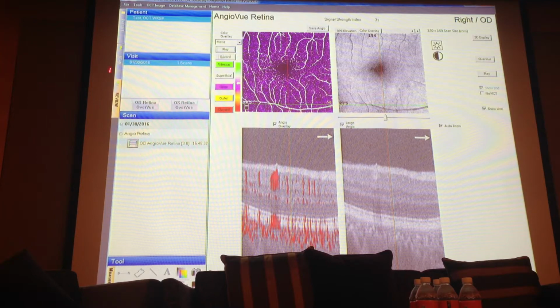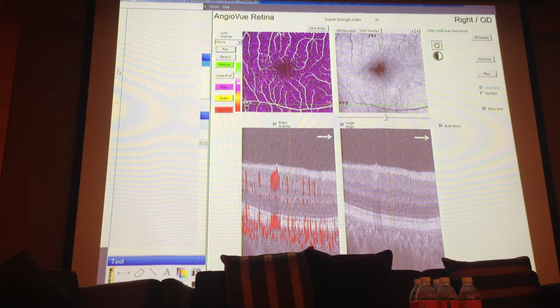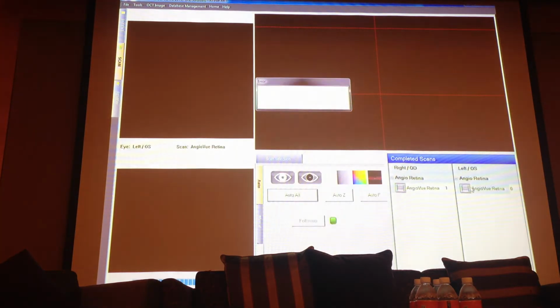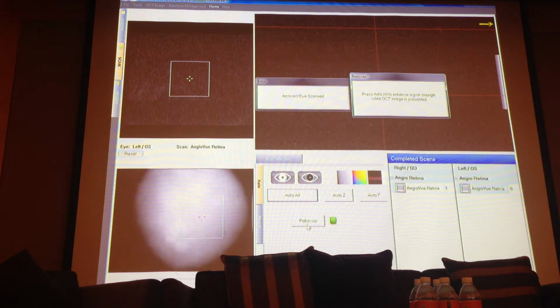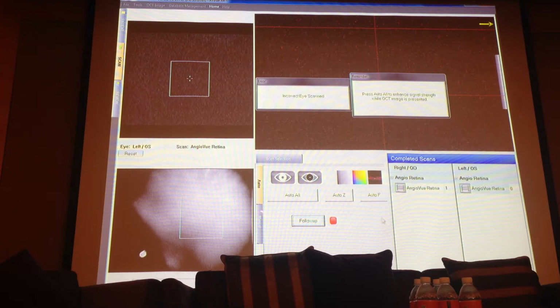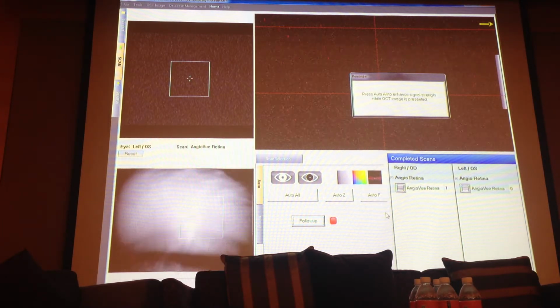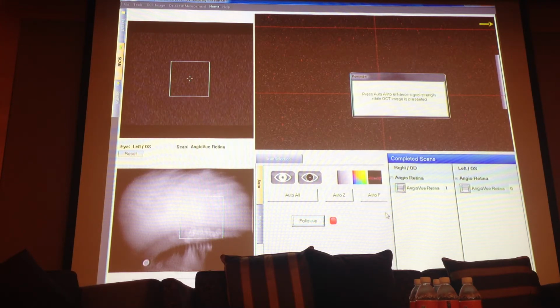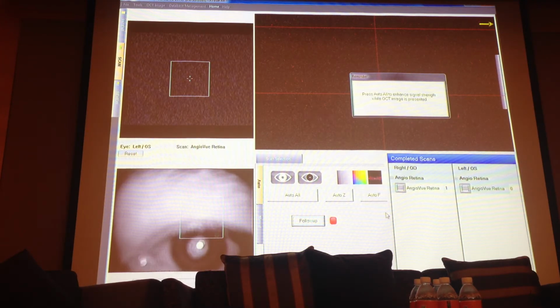Now we get back to the scan. I think we should take a 6 millimeter scan. I can't select 6 mm because of the resolution. What if you unplug the projector? Yeah, it's the resolution. I can't press the 6 mm button. So we'll just disconnect in a second.